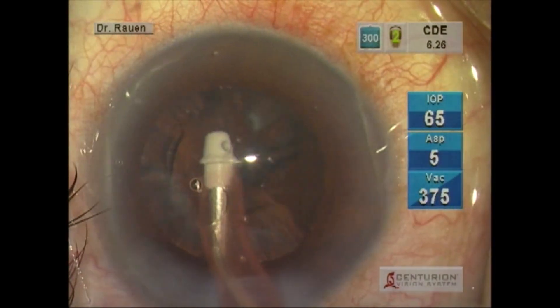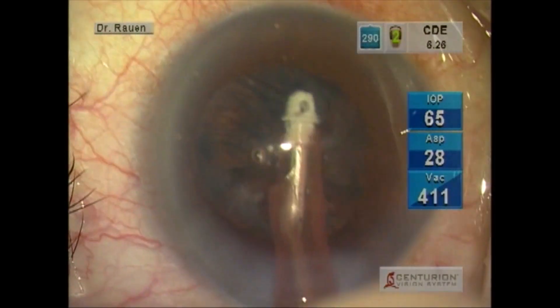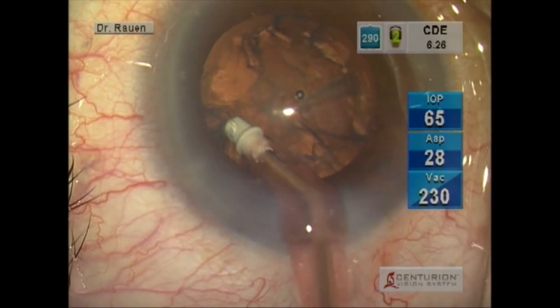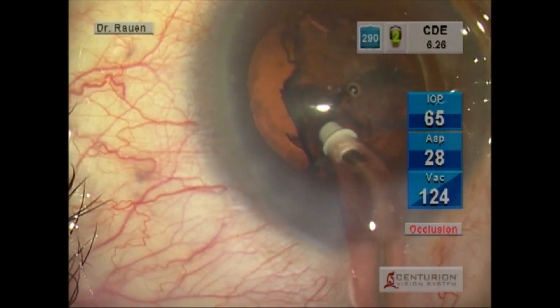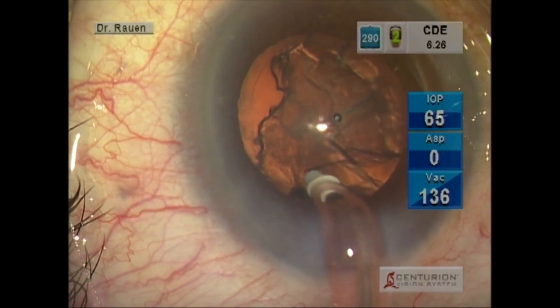Here we see no movement of the pupil — the pupil is not coming down — and even as occlusion is occasionally broken, you see very little movement of the iris and very little movement of the capsular bag.